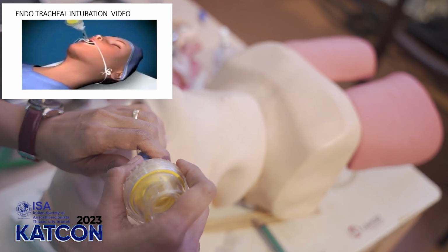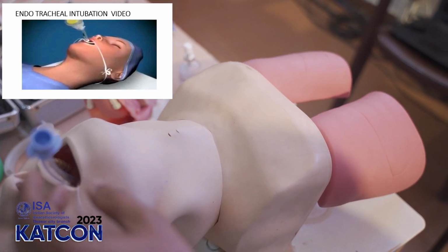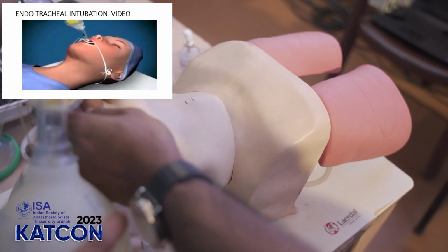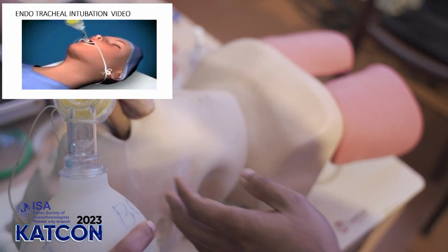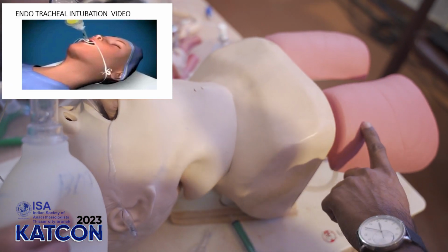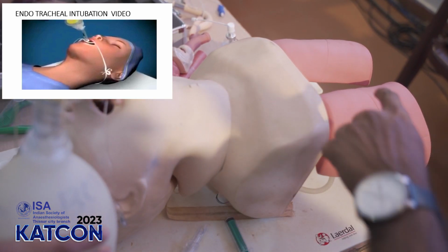Okay, I think you would have understood what the video was mentioning. If the tube goes in too much, it may become endobronchial. Then only one lung gets inflated. So you withdraw it so that you get both lungs getting inflated.